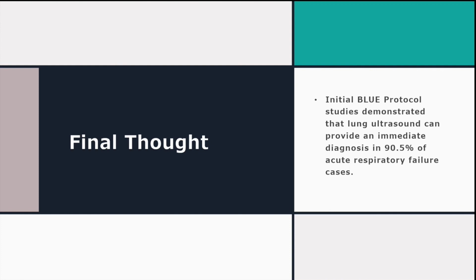Again, with practice, it takes less than 5 minutes, usually less than 3 minutes to go through the algorithm. A pretty powerful tool for a non-invasive study, since sometimes the chest x-ray isn't always available, especially during the times with COVID. It was being utilized all over the hospital, so the resources were pretty low. However, a lot of times the ultrasound is readily available. In fact, I've always been able to find one. So a very powerful tool in the arsenal, especially when resources are short, so again, during times of pandemic or low resource settings. And that's basically the Blue protocol.